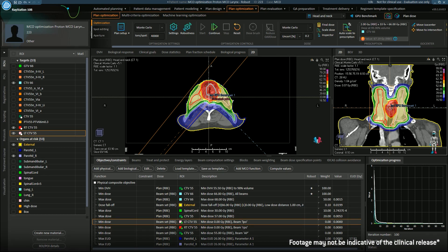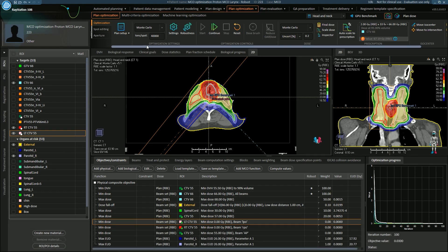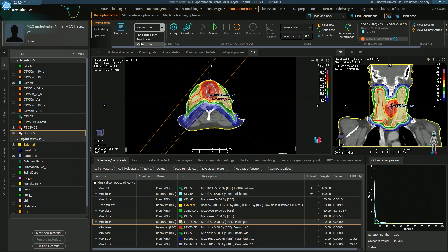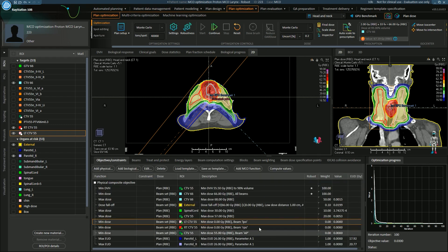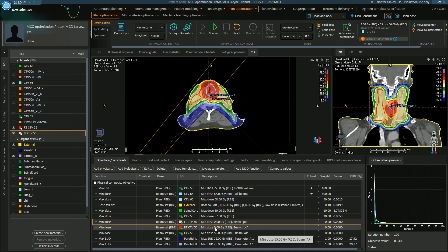Here we have a head and neck patient, which has a high dose target that we treat to 66 gray and the nodal volume, which we're treating to 55 gray. The first thing we would like to do is set our dose engine for optimization. I have three different options, but I have picked to use the Monte Carlo dose engine as this will give me the most accuracy. My final dose engine is also Monte Carlo. I can have detailed control of the energy layer spacing and the spot spacing. If we open up the objectives and constraints, we can use smart objectives to define where the spots are placed within a target.